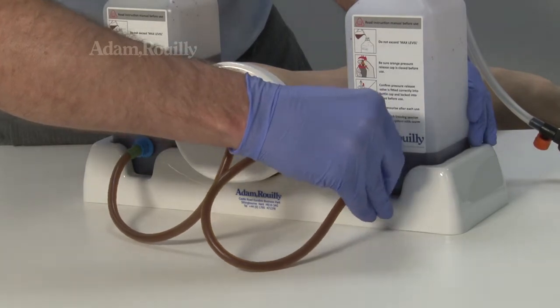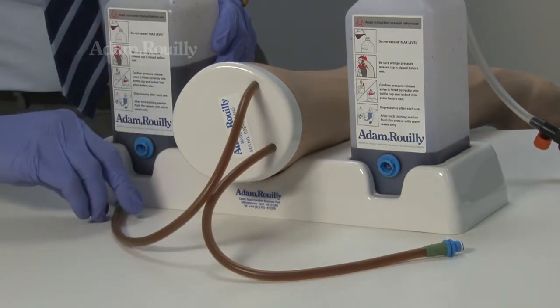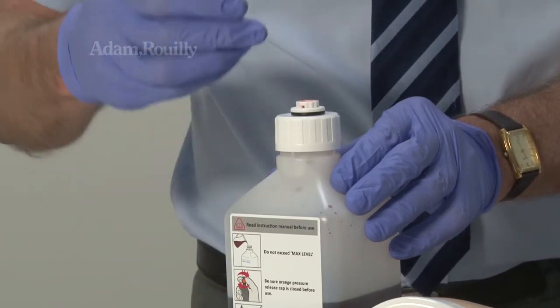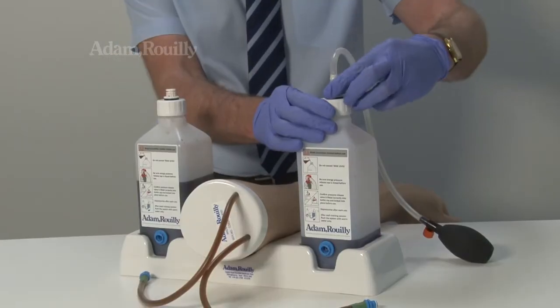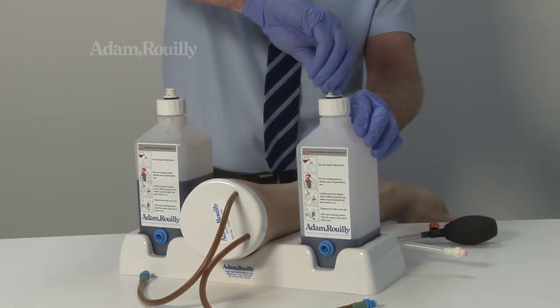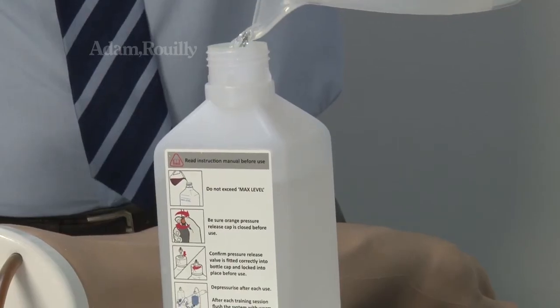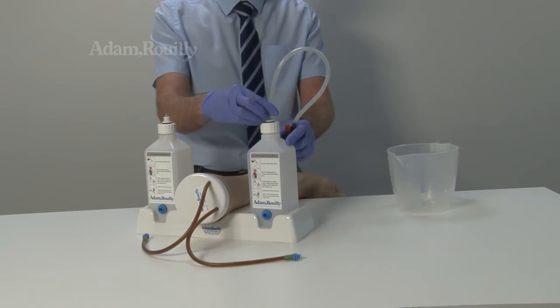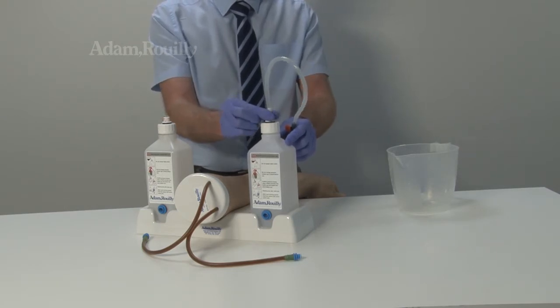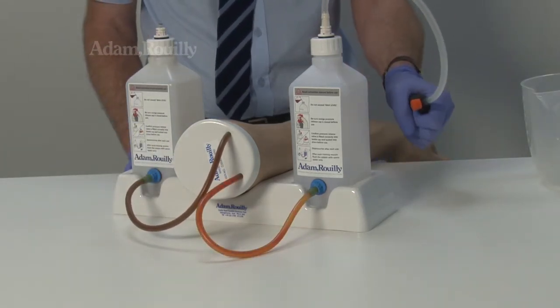After use: When training has finished, disconnect the veins from the bottles. Use the supplied blanking plugs for transportation. If the arm is not going to be used for some time, it must be cleaned before storage. Flush the system as shown with warm water, allowing to dry before storage.